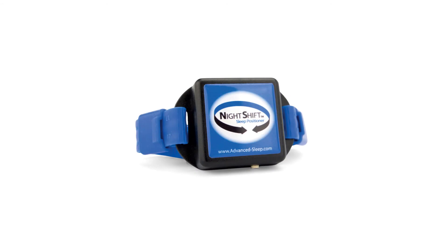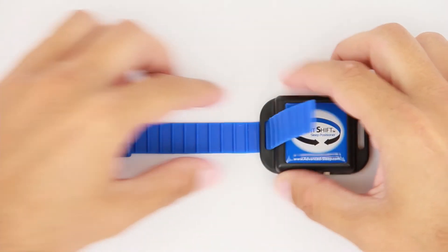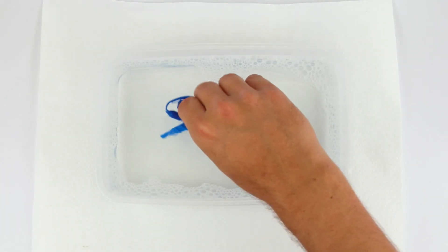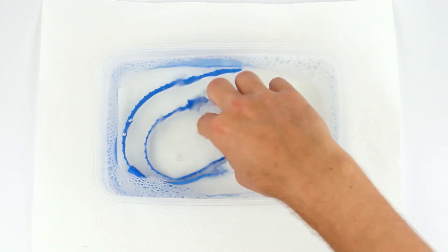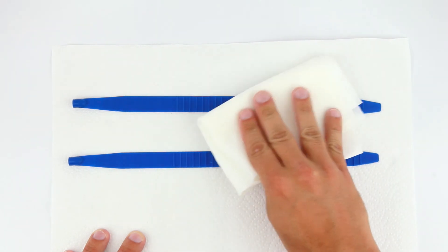The Night Shift was designed so it can be periodically cleaned. To clean the strap, detach both strap ends from the device. Prepare a solution equivalent to 1 teaspoon of a mild liquid dish detergent per gallon of warm water, or 5 milliliters of detergent per 4 liters of water. Submerge only the strap in the solution and agitate slightly for 1 to 2 minutes. Rinse with clear, warm tap water for 1 minute, then dry with a clean paper towel.